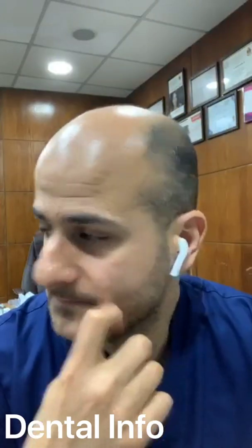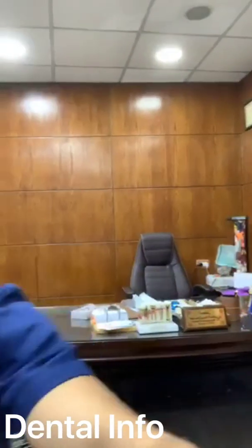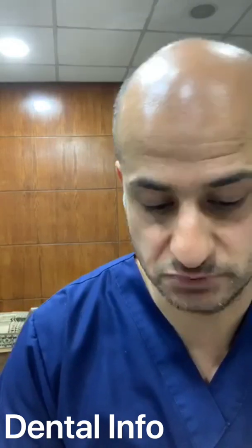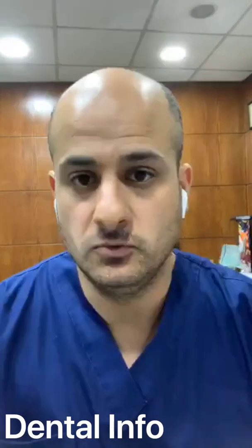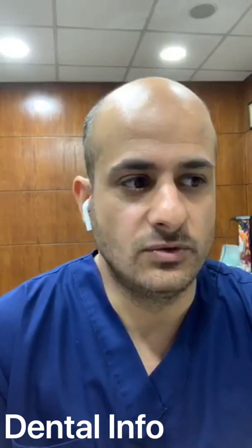A cost-effective device, a good device, you can use it. From ETIR, this is the Ultra X I told you about. I can show you the device. This is the Ultra X device. See, it's a wireless device, good, cost-effective. You can manage curved canals with this device in the irrigation aspect. I mean, you can manage fractured instruments, you can clean the isthmus. This device is amazing. When they first made this device, they told us it was just for irrigation. But now we are using it for broken instruments, for file activation. I can use it to remove gutta-percha from the walls. So it's a universal device for me.